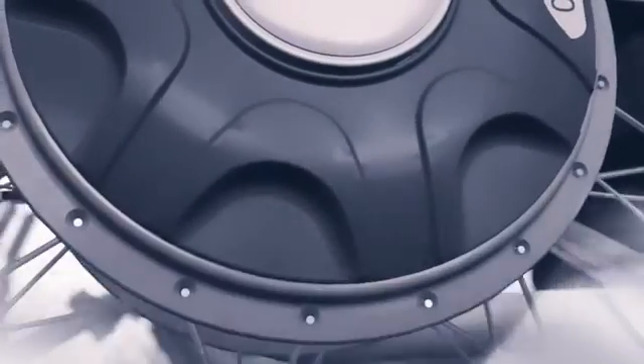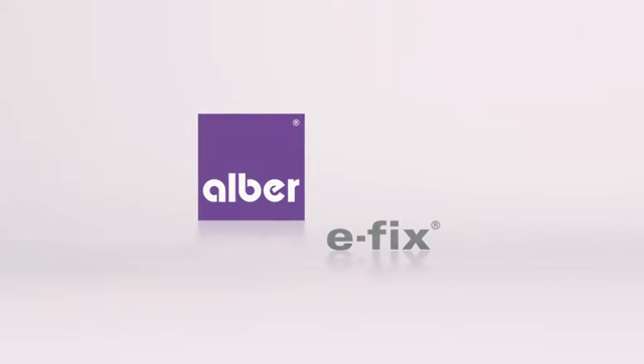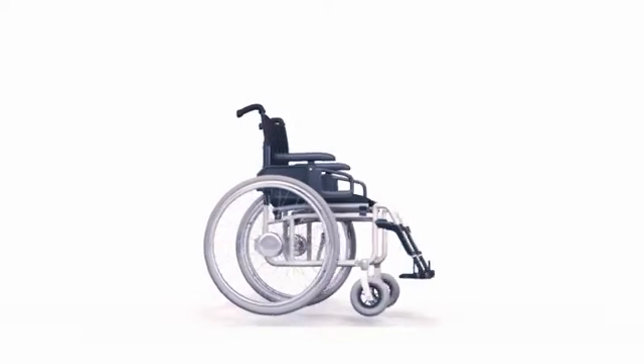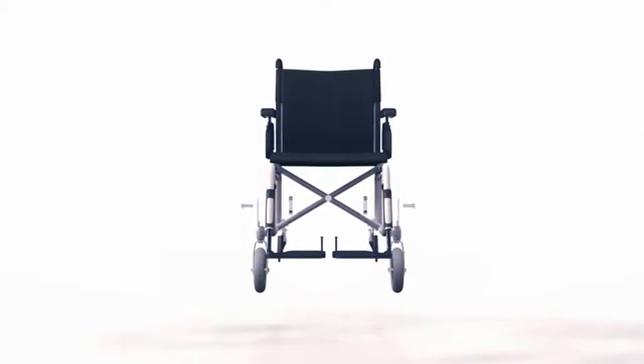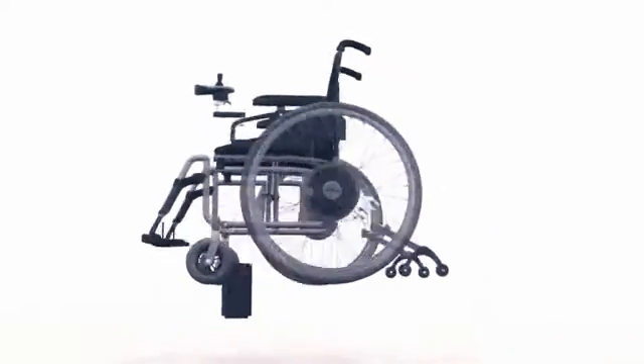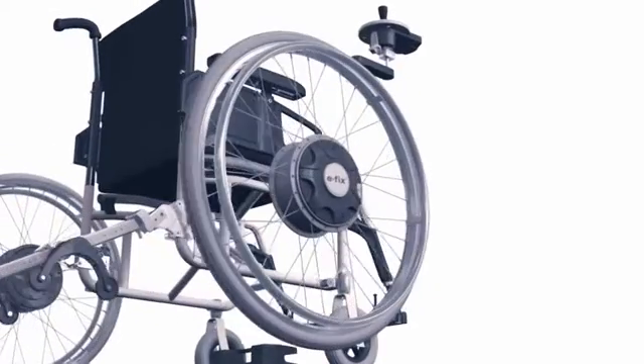eFix. Small, light, swift. Power add-on drive for manual wheelchairs. eFix turns your manual chair into a small, compact and very light power wheelchair.